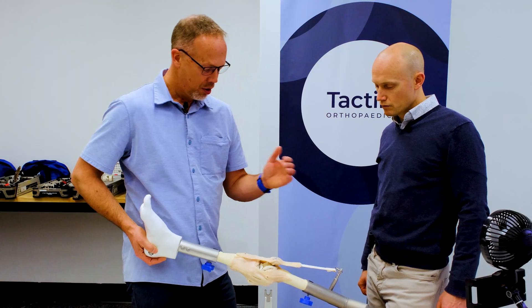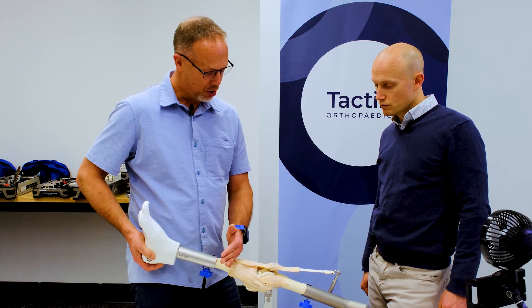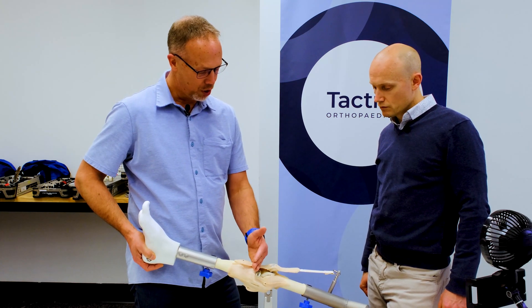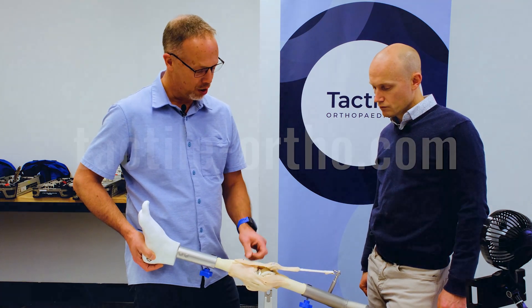Tight in extension, tight in flexion — symmetrical problem. Deal with it on the tibial side. Lower the joint either by minimizing your polyethylene or recutting the tibia if we have to.